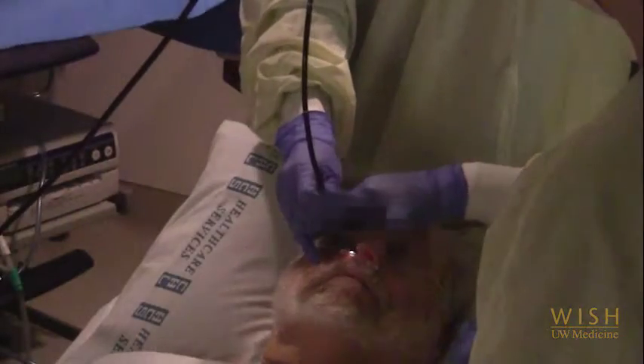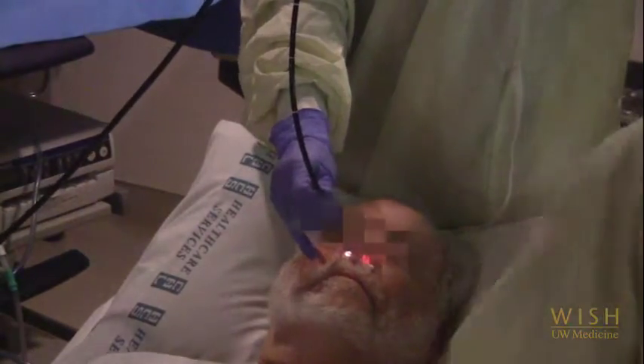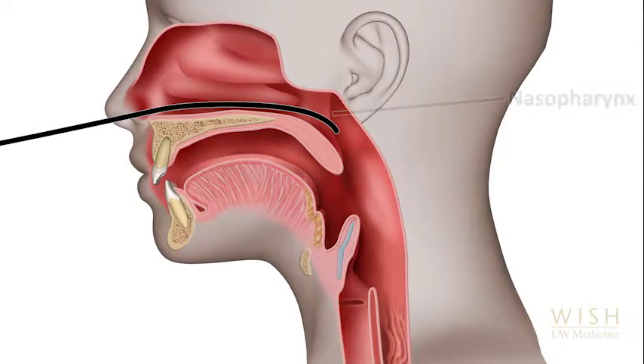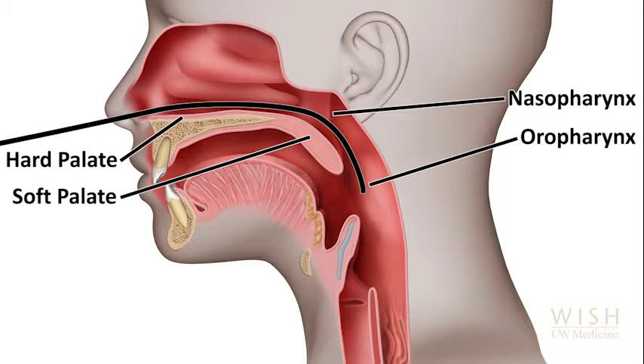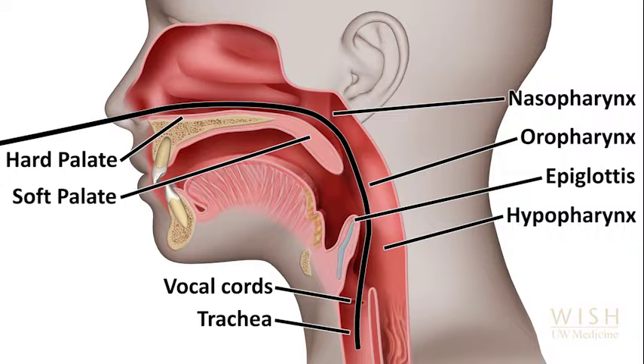You can see the bronchoscope being inserted into the right naris. The bronchoscope is pointing directly perpendicular to the face. The bronchoscope must navigate the nasopharynx, traveling parallel to the inferior turbinate. It passes over the hard and then the soft palate into the oropharynx, and then posterior to the epiglottis into the hypopharynx, before entering the trachea between the vocal cords. The scope will generally pass through the nose more smoothly if you keep your thumb on the control lever but don't direct the scope too much. Usually the tip will follow the correct path on its own, much like placing an NG tube.